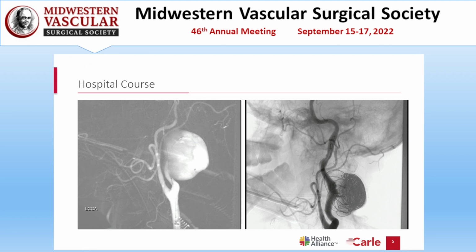So a PRECISE stent was placed into the distal ICA to allow for ease of cannulation, after which 2 flow diverter stents were placed extending down from the distal tip of the PRECISE stent into the more proximal ICA, and then the aneurysm was coil embolized to decrease flow and help with thrombus formation in there.